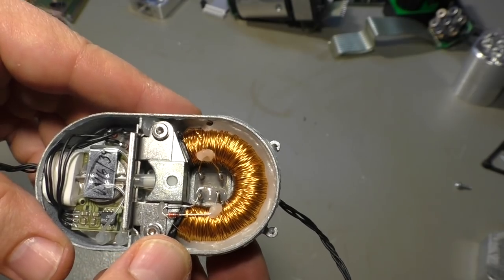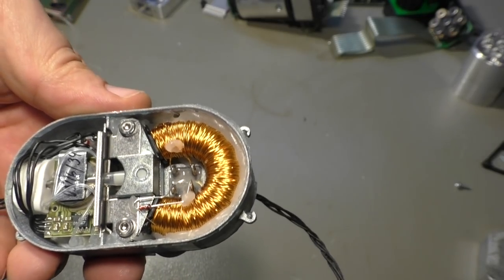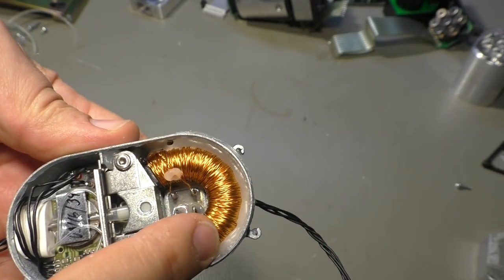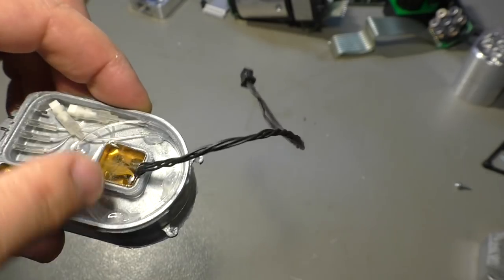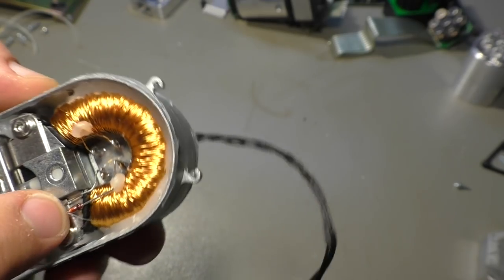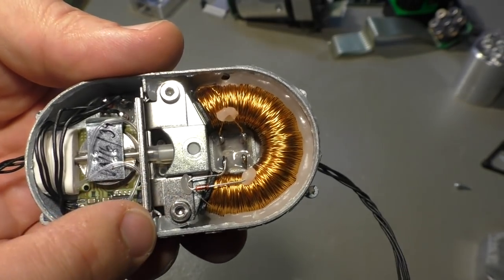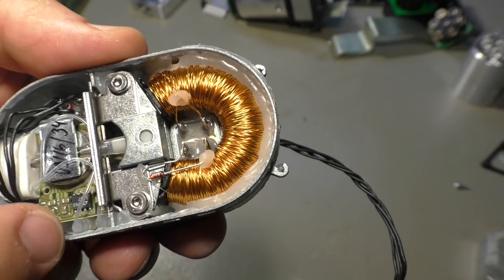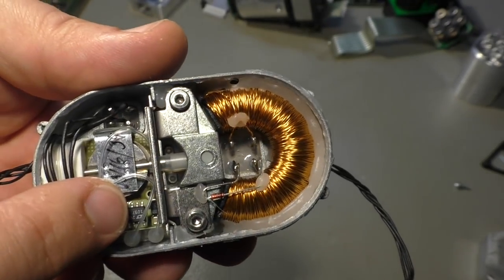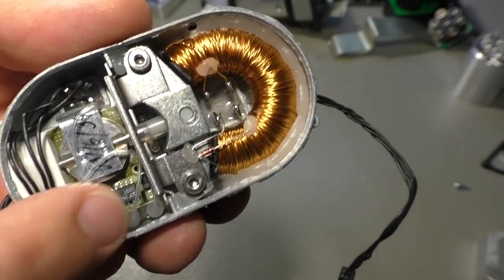And that's an oxygen sensor. And the way how it works is really clever. So you see a big coil here that is connected to that connector here with diodes. So I'm pretty sure that's a thermal sensor. This diode, they use it as a thermometer. Then we have gas lines for the oxygen mixture. And we have some electronic parts here.